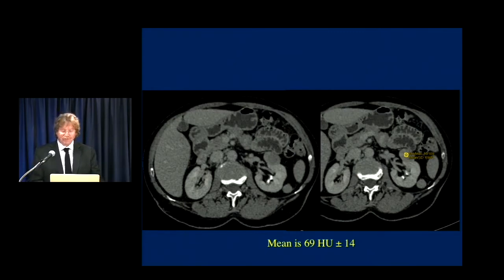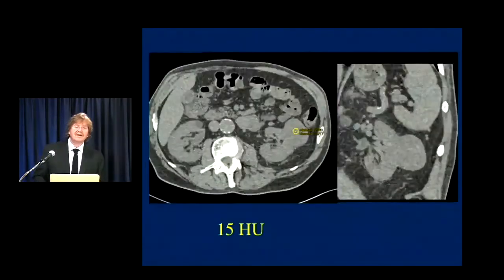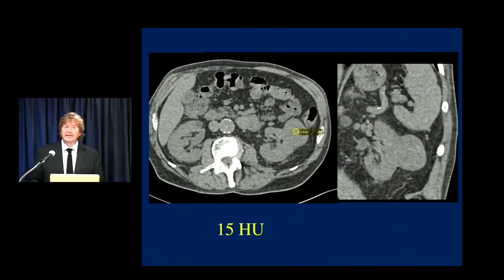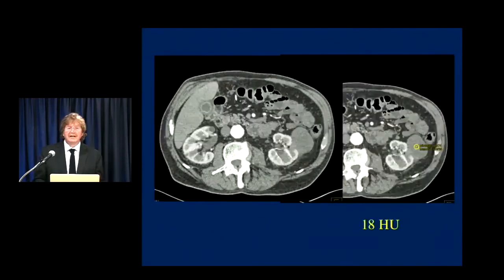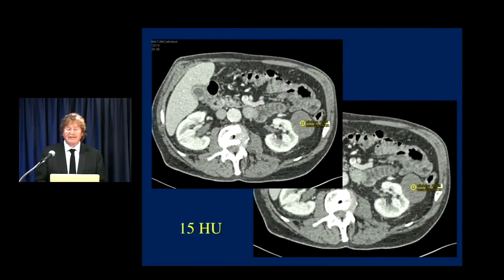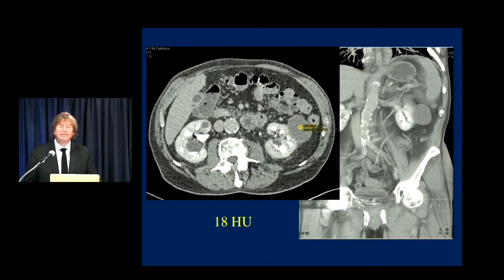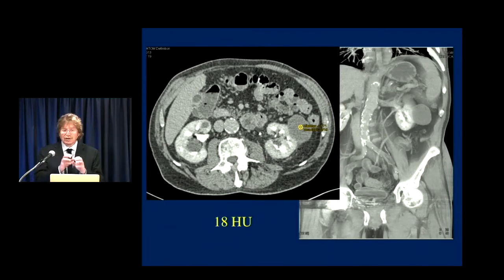Another example: a lesion looks solid but measures 15 Hounsfield units — under 20 is most likely benign, but it doesn't look like a simple cyst. On arterial phase it measures 18, on venous phase 15, on excretory phase 18. This lesion did not enhance — it stayed the same within two or three Hounsfield units, classic for a high-density renal cyst. If you only visually look at the lesion, you're thinking tumor. So it's very important to measure tumors. One of the mistakes is assuming something is benign when it's malignant, or vice versa. Using a cursor about 1 cm in size works very nicely.